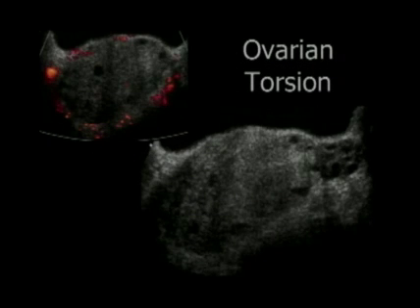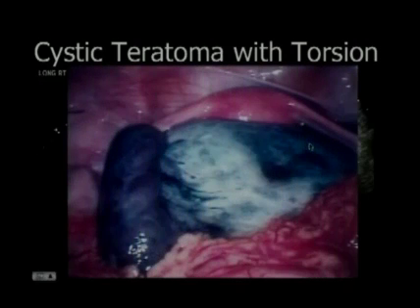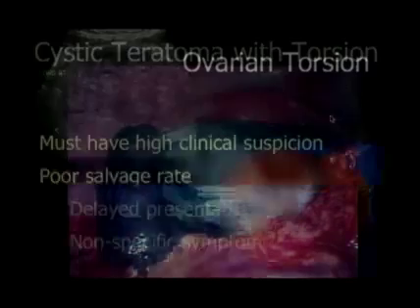So here's a classic case in a teenage girl with acute pain. We have a very large ovary with peripheral follicles, and here's the normal ovary for comparison. Certainly this thing is grossly enlarged and not much doubt about the diagnosis. This child also had acute pain, had a rather complex looking ovary, maybe some peripheral follicles. We did not see any calcification or fatty mass. This kind of looks like a fimbriated end of a fallopian tube to me. And here's a laparoscopic picture showing the uterus down here with the broad ligaments. Here is the torsed fallopian tube, and here is a large torsed necrotic cystic teratoma in this young girl.